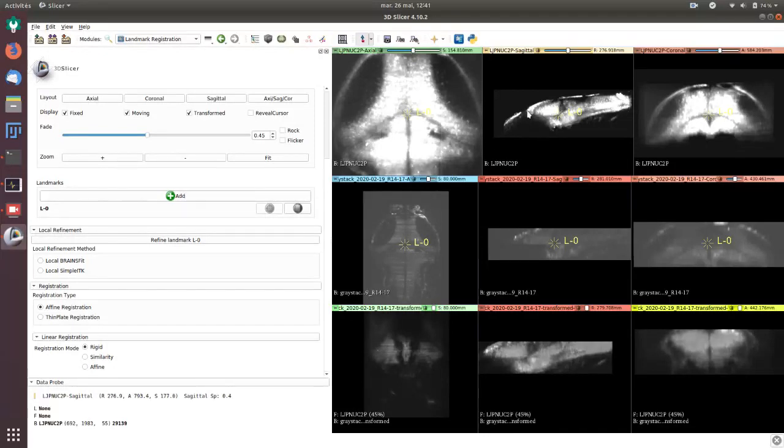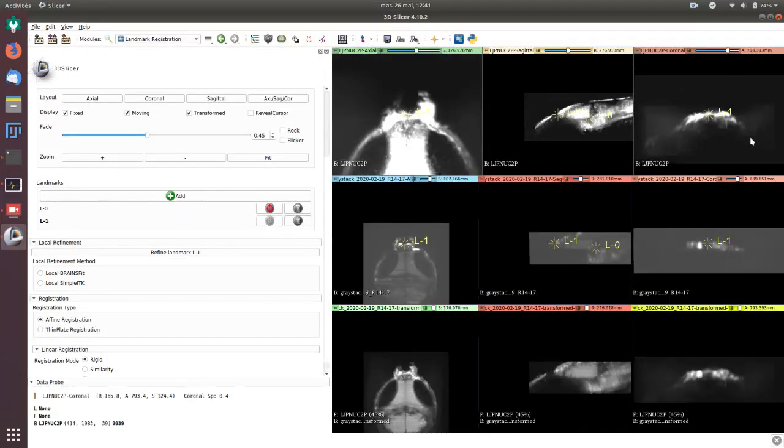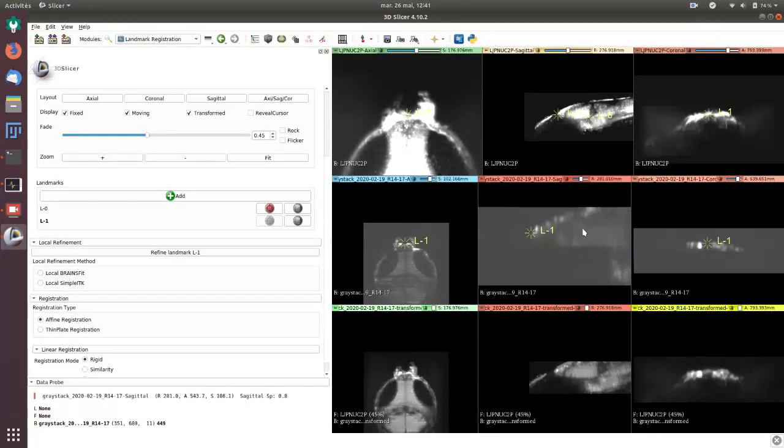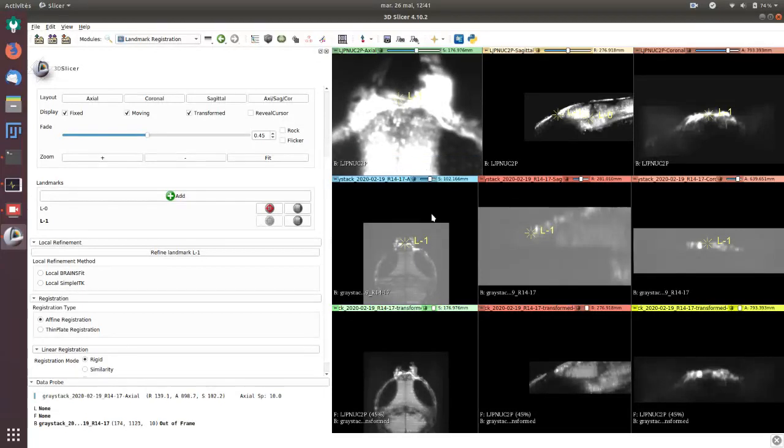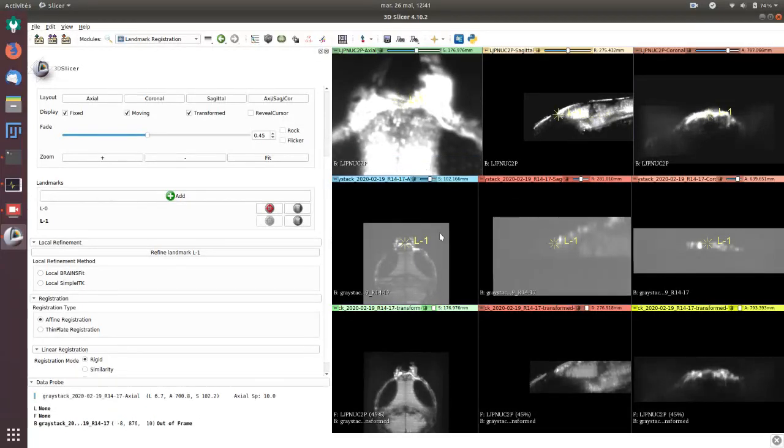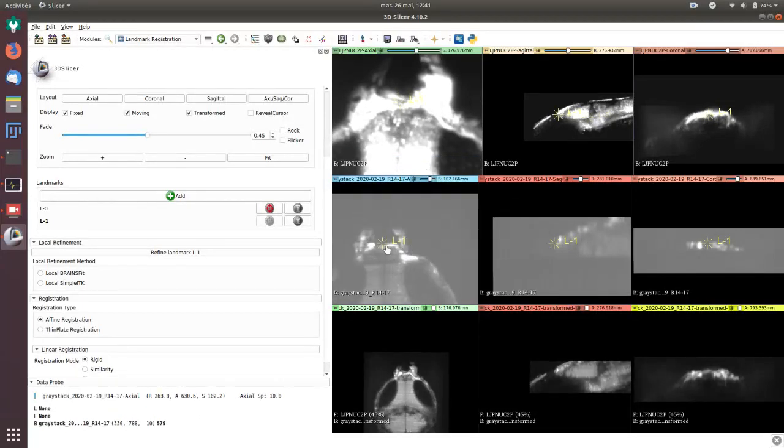I continue by adding some more landmarks. I can click wherever I want. Here it looks like it's quite the same point in the habenula region.